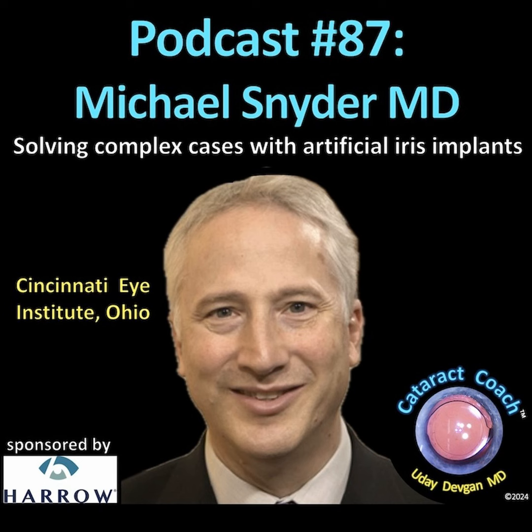And once somebody's done the online training course, the distributor will send them the wet lab supplies, or really dry lab supplies, using Stuart Stoll's simulis that were developed strictly for the artificial iris, to practice in their own operating room with their own instrumentation. And once they're comfortable with the techniques, well, then it's time for working on real humans. Right. But it's a really nice way to do things, because you can take those stages as fast or slow as you feel comfortable with.